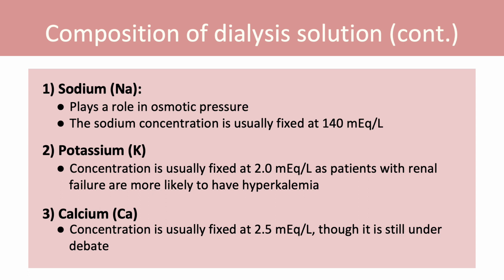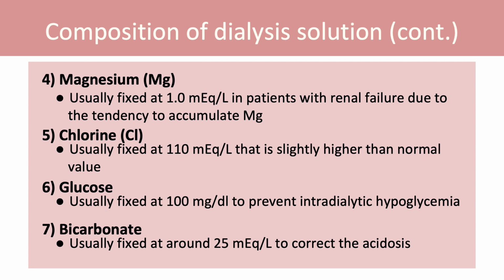However, there are various symptoms of both high and low levels of calcium, and there is still a lot of debate about the concentration of calcium in dialysis fluid. The fourth is magnesium. Since there is a tendency of higher magnesium concentration in patients with renal failure, a lower concentration of 1.0 milliequivalent per liter is the mainstream.